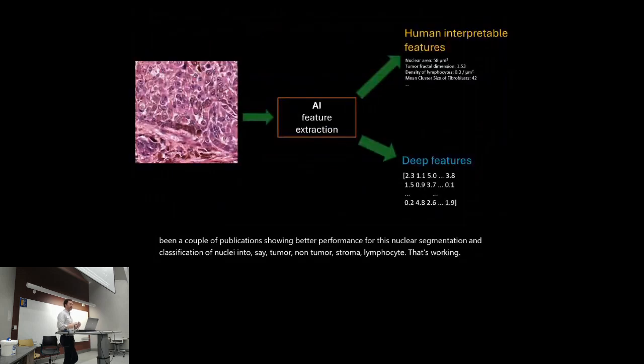All right, next let's talk about these deep learning-based features. Again, these features are just going to be vectors or matrices of real numbers. They bear no relation to anything that humans can interpret. We don't know what any individual feature means, but we know that comprehensively they're very expressive about what's going on in these images. We just need some further deep learning based tool to work on top of those features to tell us to do some task based on those features.